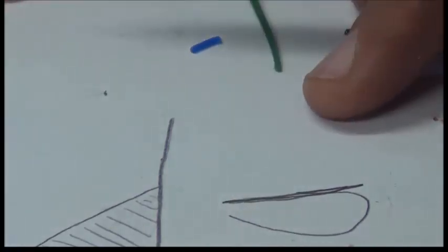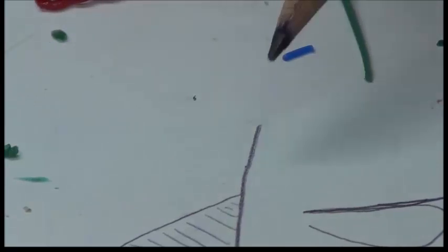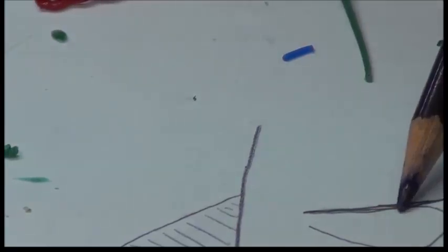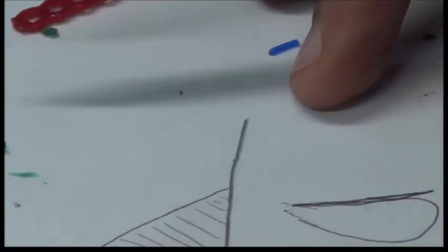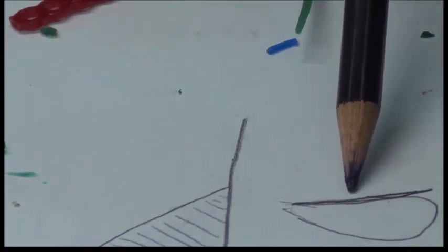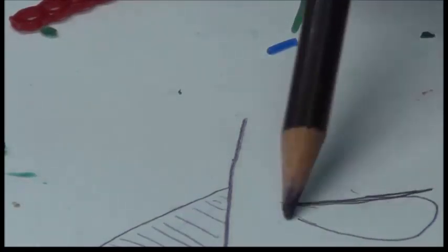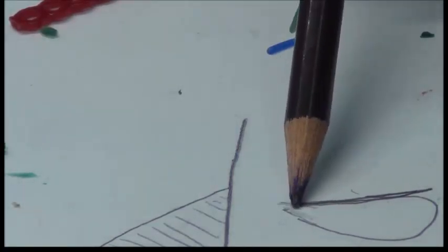It has another feature. It has a thick area and a thin area. The thick area should be downwards. The thin area should be occlusally. So once more, it has two sides, flat and rounded, and it has an upper and lower edge. The lower is more round, and the upper is more tapered. So this is how we orient this on the cast.